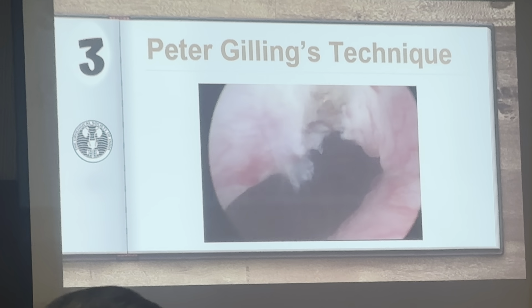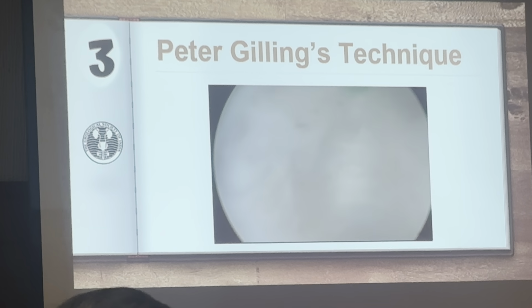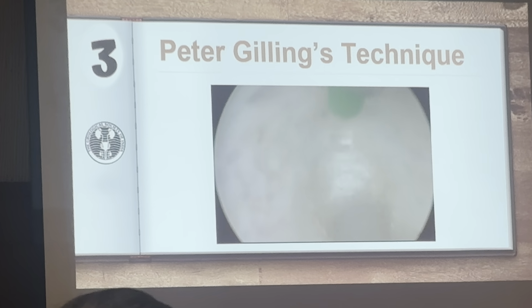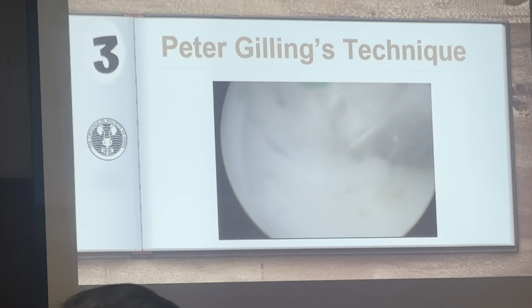Now we are taking down the 12 o'clock incision. Right at 12 o'clock, we have to be quite careful whenever we are coming from the bladder neck proximally. We have to make sure that we are not progressing beyond the veru, and there is no veru, so you have to have a landmark which mimics the veru at 12 o'clock.